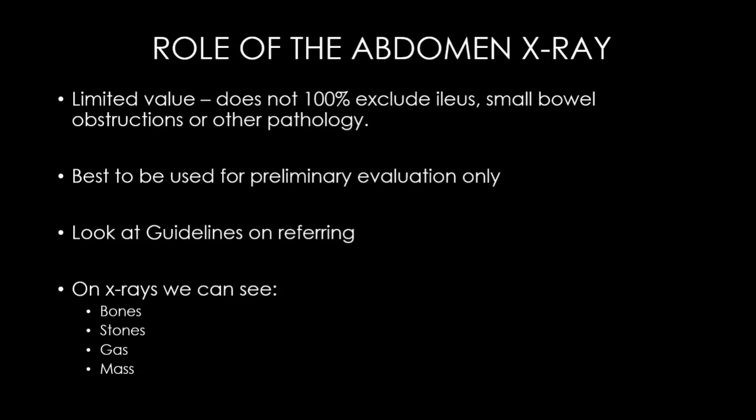Supine abdomen x-rays may help in patients with obstruction due to adhesions or post-operative patients distinguishing paralytic ileus from obstruction. And we did a video on paralytic ileus earlier, so please see that for more details. CT and ultrasound have higher sensitivity.